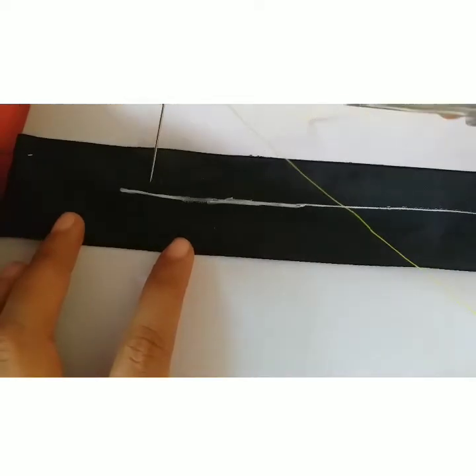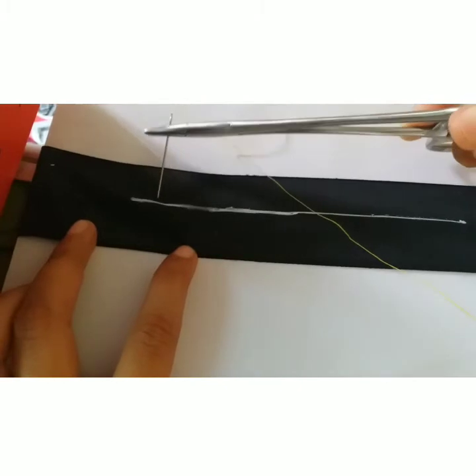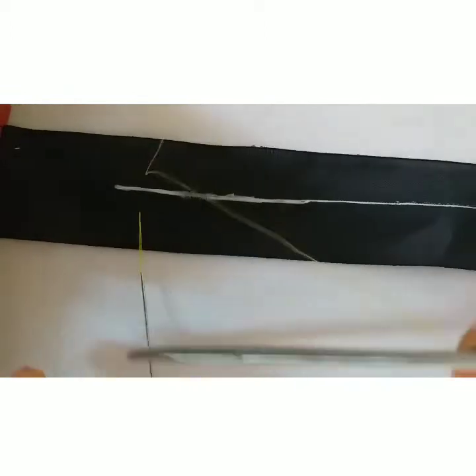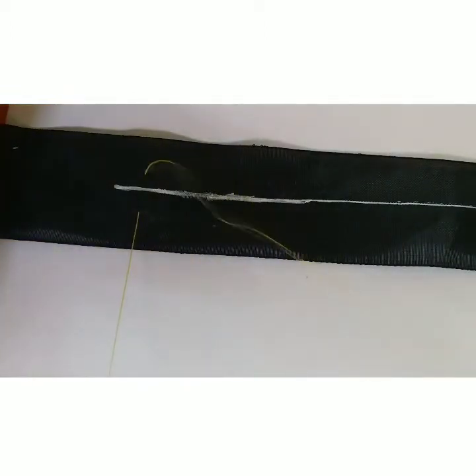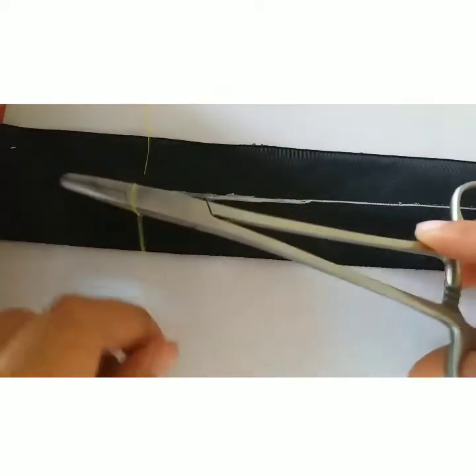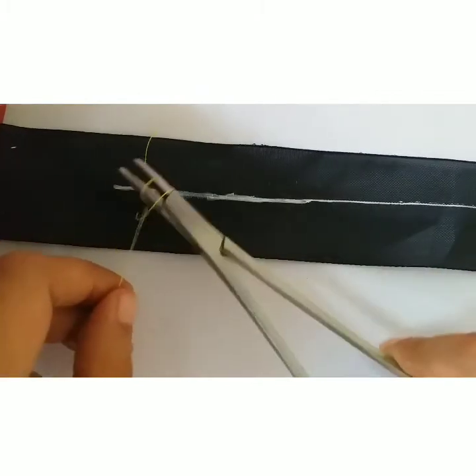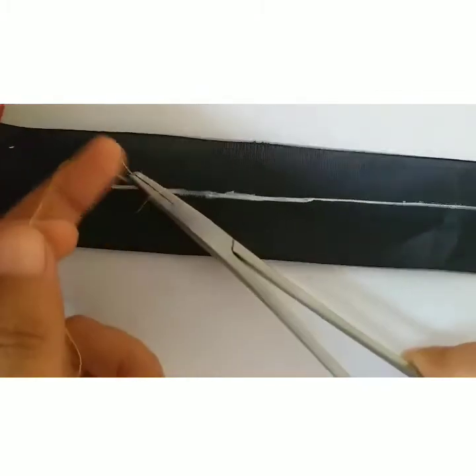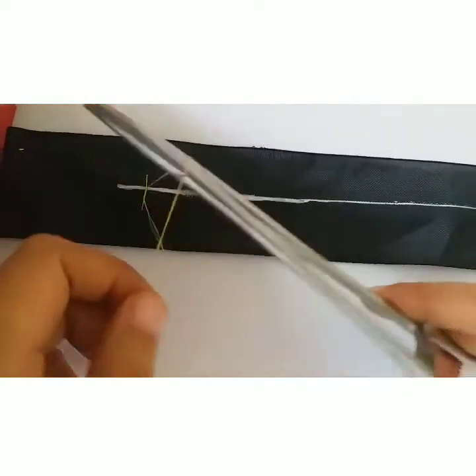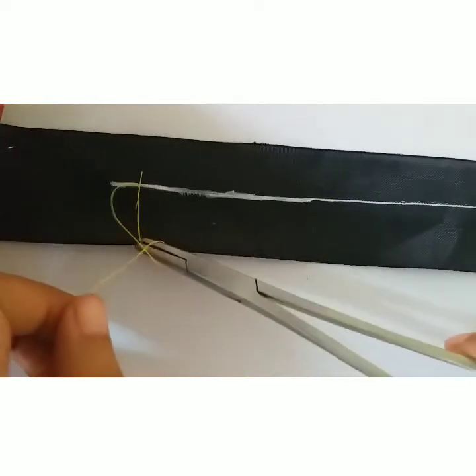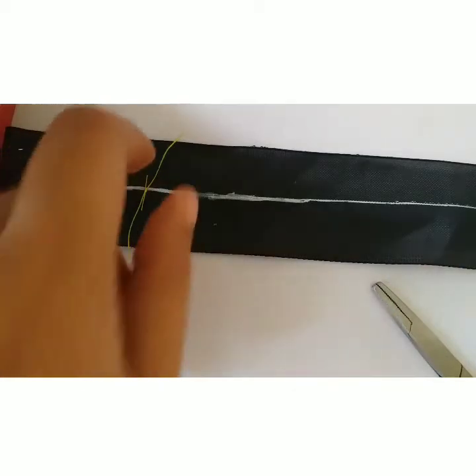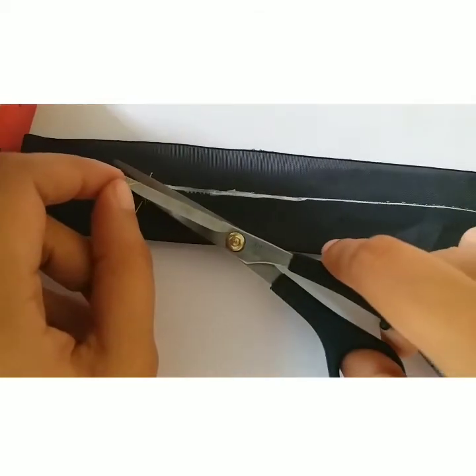For simple continuous suture, we will first perform a simple interrupted suture. We will pass the needle, then two throws away from you moving the hand towards you, and then a throw towards you moving your hand away from you. This completes the surgeon knot. After this, we can do two additional throws for a firmer grip.